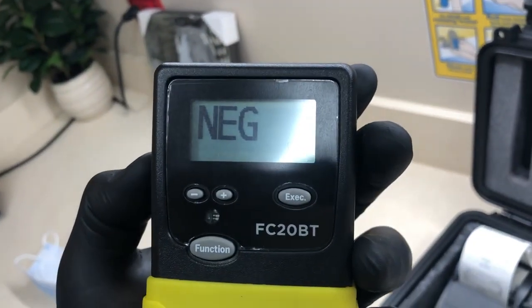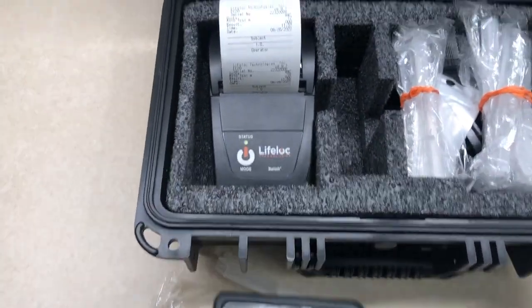So, quick example. Quick little negative. And then, like I said, if you want to print it again, you hit the print, and it'll tell you negative or positive. This one doesn't give you actual numbers.